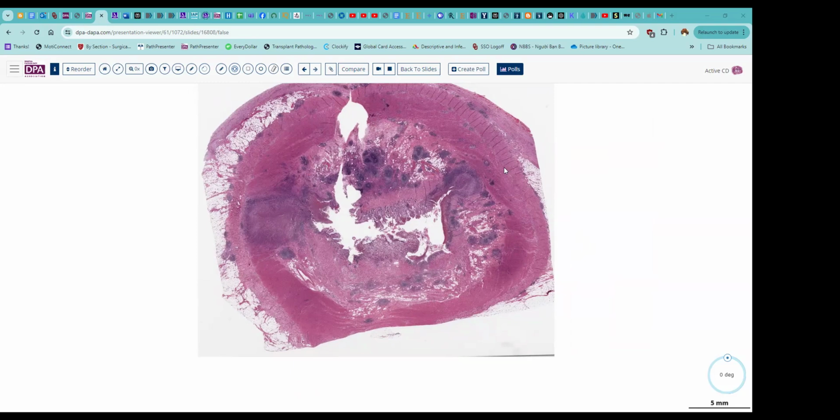So lymphoma is an uncommon entity in the bowel, but certainly a dense lymphoid inflammation that was distorting the mucosa and filling the submucosa could be an indicator for lymphoma.